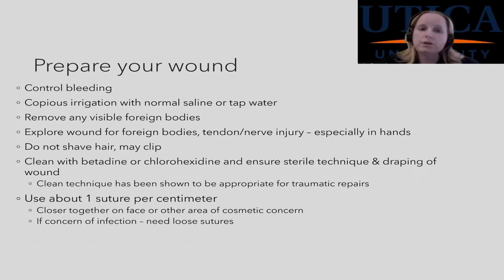You need to really make sure you're irrigating with normal saline or tap water. Make sure you clean out wounds well to prevent any kind of infection. If you see any foreign bodies, remove them. Explore the wounds for foreign bodies and also look for any nerve or tendon injuries, especially in the hands.